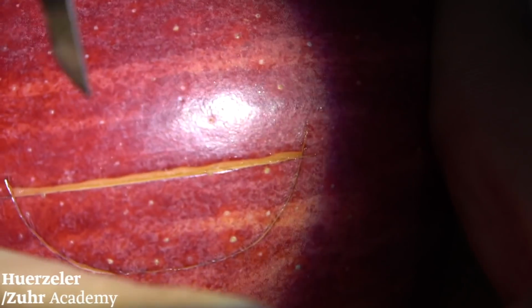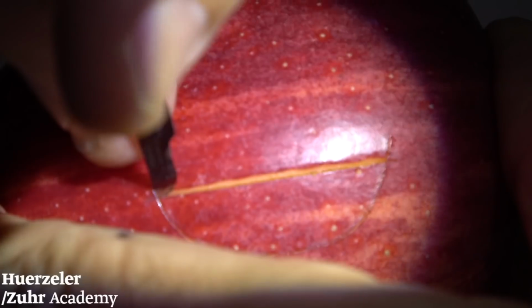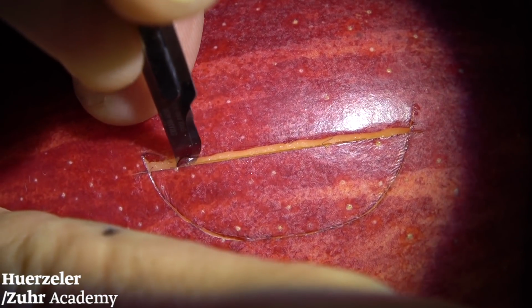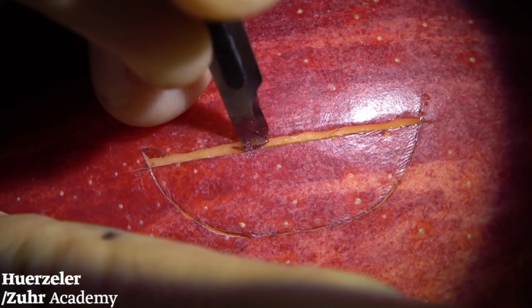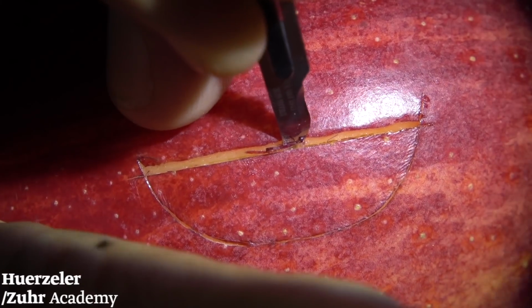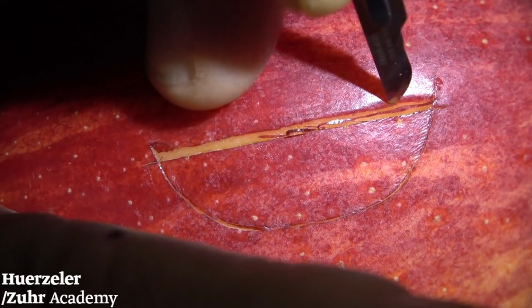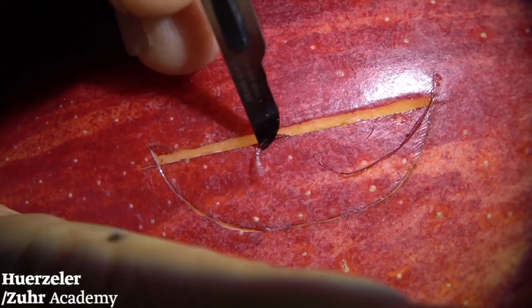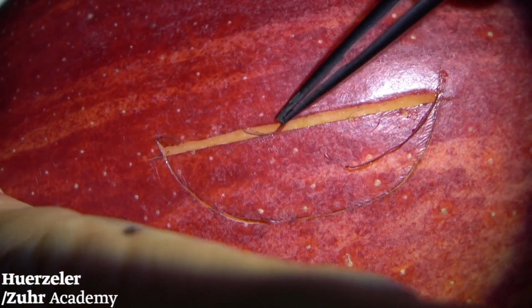Now let's have a look. Now I can see already the point where I want to start to go in the connective tissue. You see down there? This is how I start. Maybe I cut a little bit more sometimes there, doesn't matter. This is exactly the point where I want to go into the mucosa to create at the end the perfect flap, specifically here now in the coronal area. This is the difficulty.